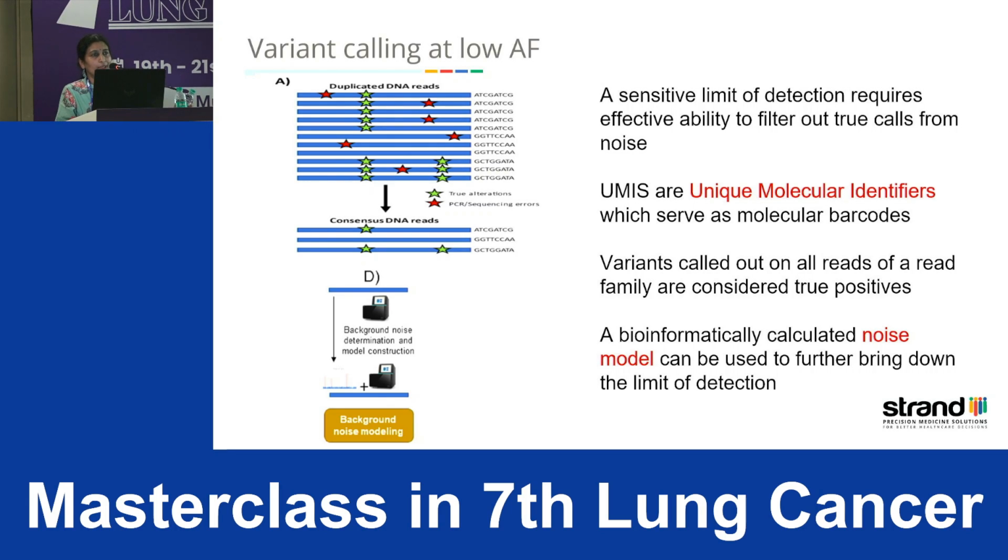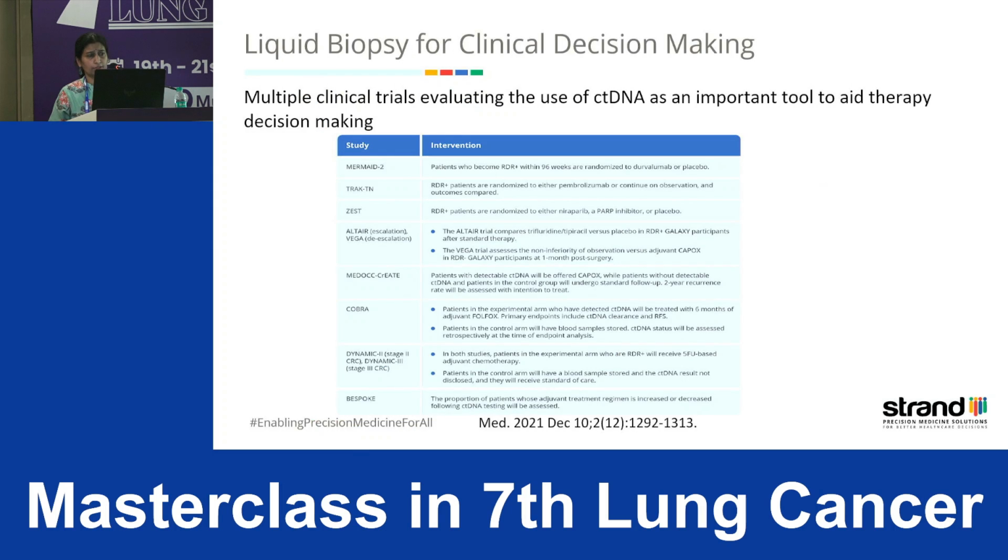So long story short, I'm trying to say that there's much that goes on in trying to get an assay to be able to call out variants at such a low allele frequency. So that's about the assay. Now I'll go to the applications.